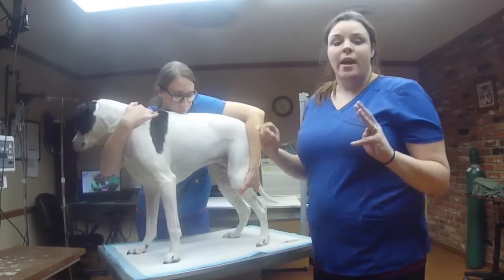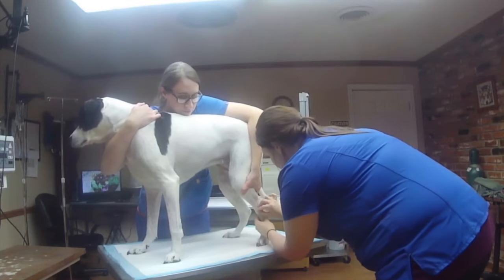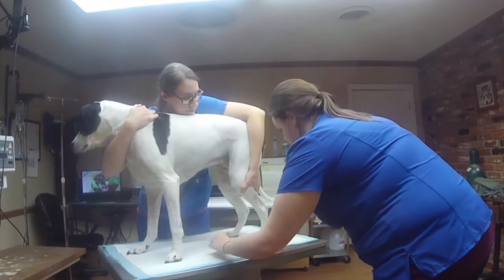We are going to do a lateral saphenous blood draw. So you want to clean the area, and then you're going to go bevel up.